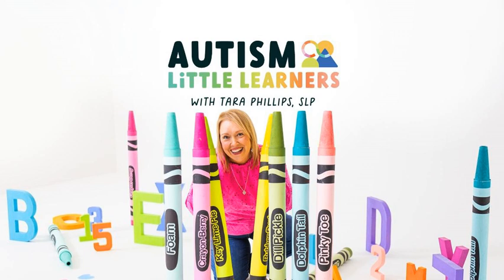And this means the AAC device is used to express what the child might be thinking or feeling in the moment. For example, if a student's upset about leaving the playground, you might model don't want, sad, more slide on their device. If they're laughing with a friend, you might model fun or love this. Modeling from the child's point of view helps validate their emotions, builds empathy, and shows that all messages, especially those expressing disagreement or frustration, are valued.